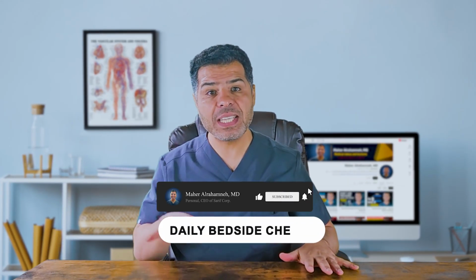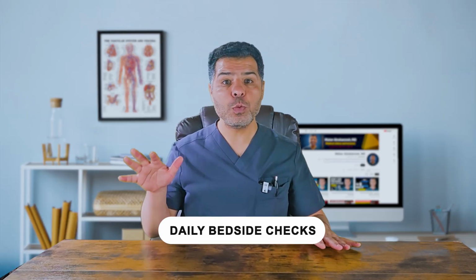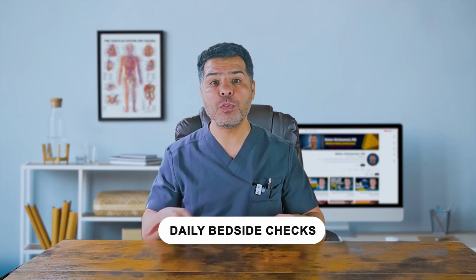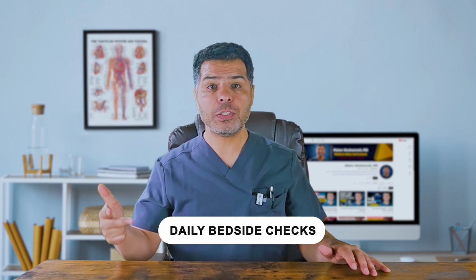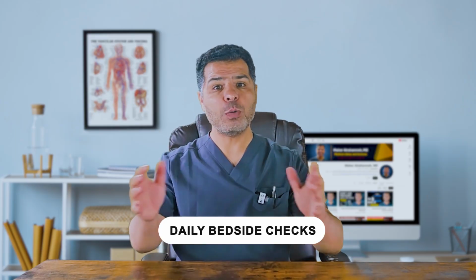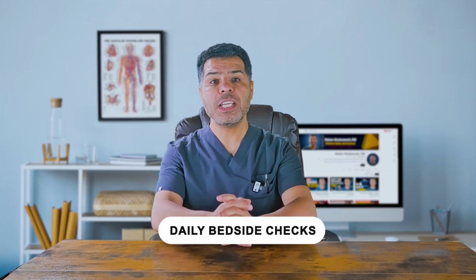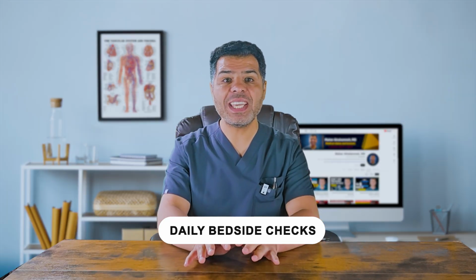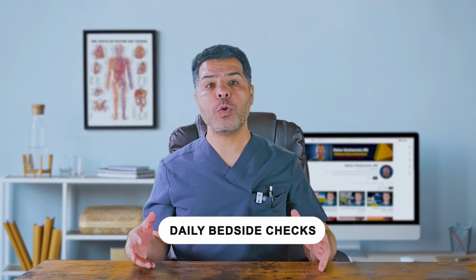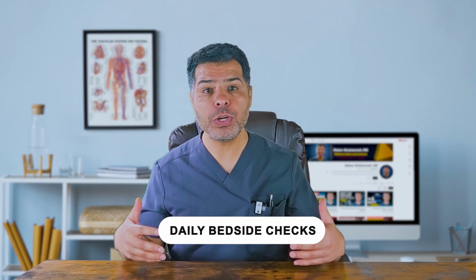Now, what are the daily bedside checks when rounding on patients with Foley catheters? Every single day, we should be asking ourselves, does the patient still need the catheter? If not, remove it, please. Check urine output and characteristics. How much urine has drained? Is it clear, cloudy, bloody? Cloudy, foul-smelling urine might suggest infection. But remember, colonization is extremely common with Foley catheters and does not always mean infection. Do not treat cloudy urine or a positive culture without symptoms, please. Next, assess for obstruction. Is urine draining adequately?